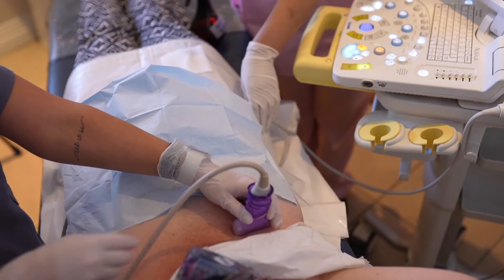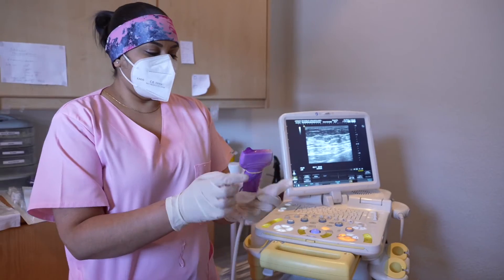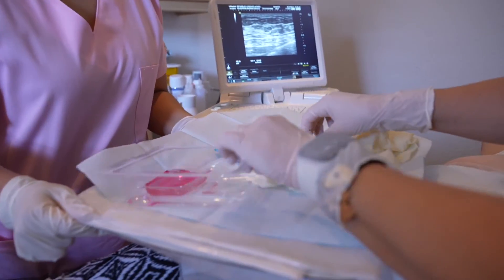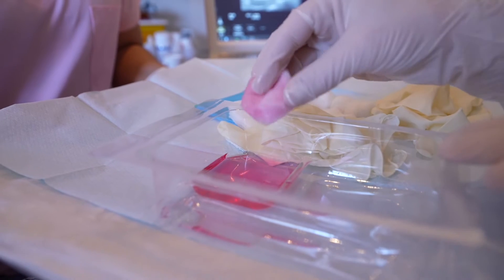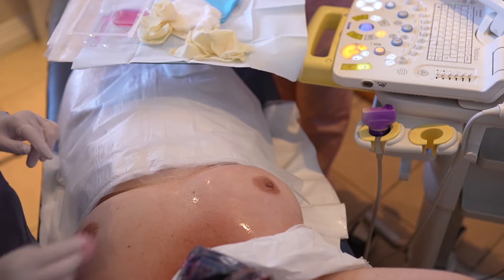The patient has been counseled and informed of the procedure and has signed consent. The patient is undressed and positioned on the bed in the ultrasound room, considering the desired procedural approach and patient comfort. The skin is cleaned and disinfected.